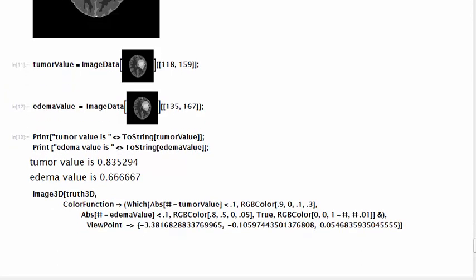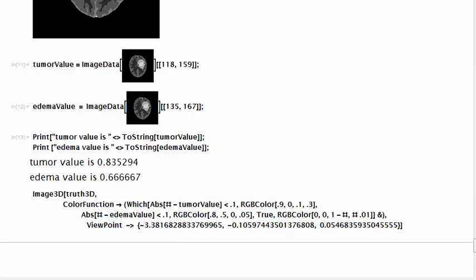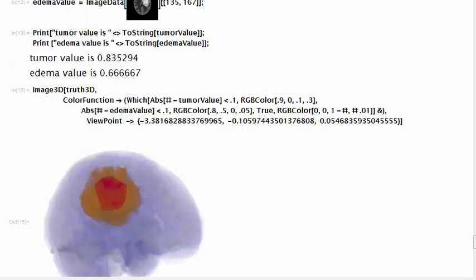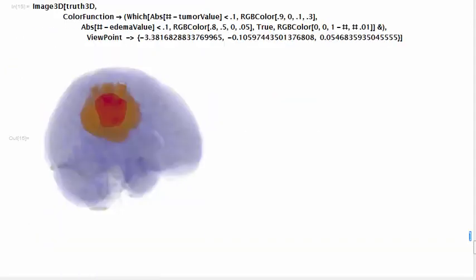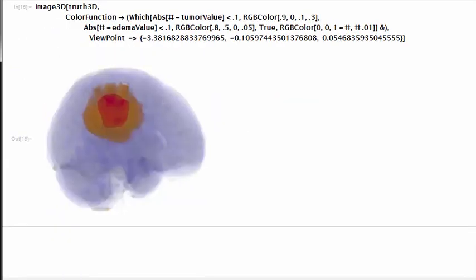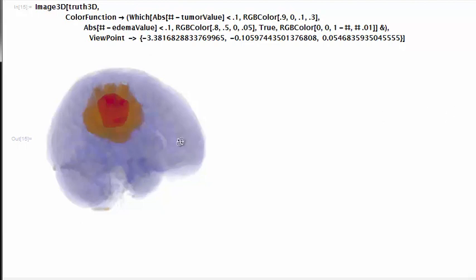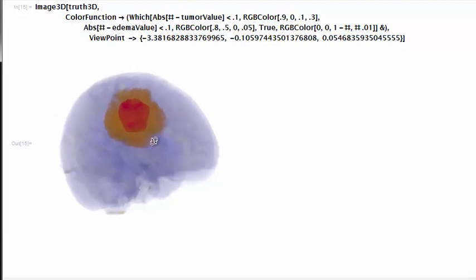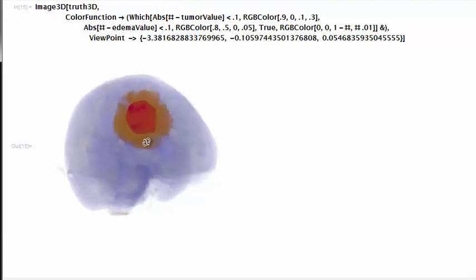By defining a viewpoint, we specify an XYZ coordinate for the camera used to look at the volume. You can play and modify this to get different views on the brain. This is the one we get with this definition. Knowing the relative size and position of a tumor is valuable when planning treatment.